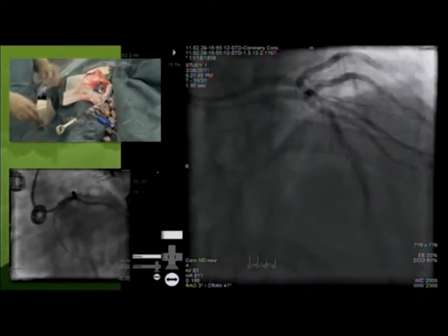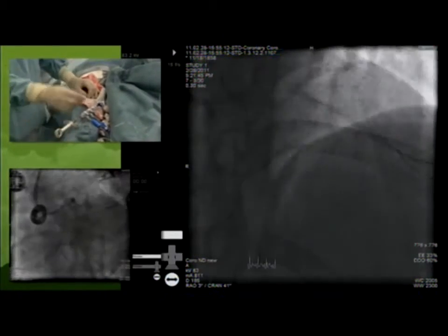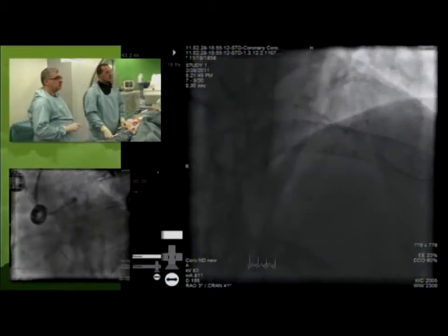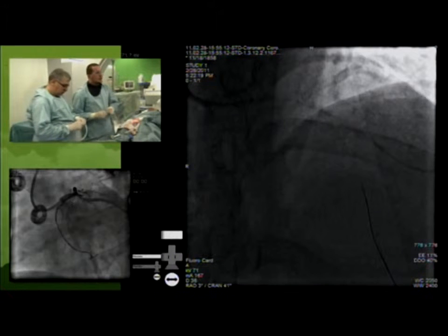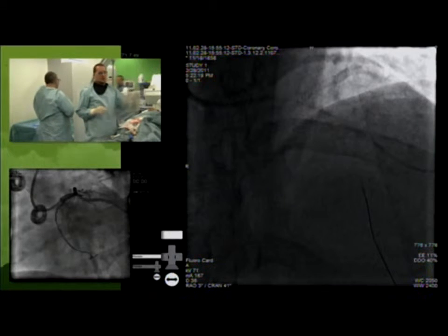The comfort that you have is that you've secured your side branch from the beginning of the procedure, and you don't have to worry about it in the end. If you have a large side branch, as you see here, this side branch is clearly stented, it's finished off now. There's a 2.25 millimeter stent in the mid portion, and then there's the Tryton stent going up there. What we're going to do now is put a larger balloon on the side branch wire just to optimize proximally before we have to recross. And then normally you quite easily drop the side branch wire. Since the side branch is secured and stented, you can just drop it into the main vessel, dilate again, and recross with a workhorse drug-eluting stent.